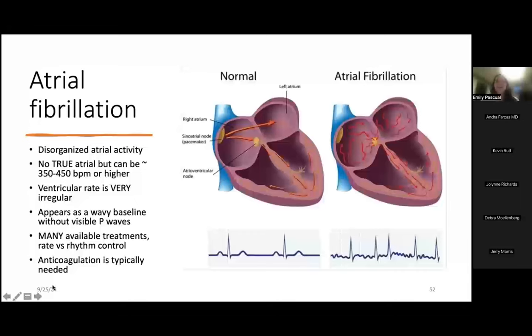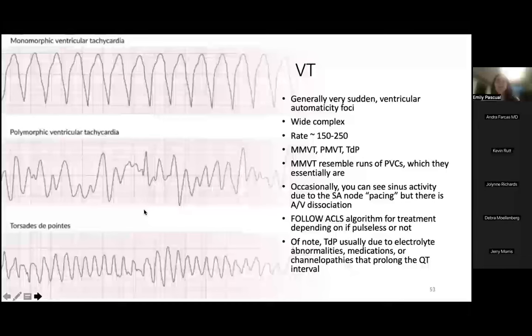A lot of times patients can tolerate AFib and flutter relatively well. Sometimes it can obviously cause hemodynamic instability when the ventricular rates are really rapid and they are hypotensive. And in that case, it may make sense to cardiovert them on sort of risk versus benefit, even if they're not anticoagulated. They should definitely be anticoagulated after cardioversion, though, because there is some stunning of the myocardium after we do that. Okay, so VT.